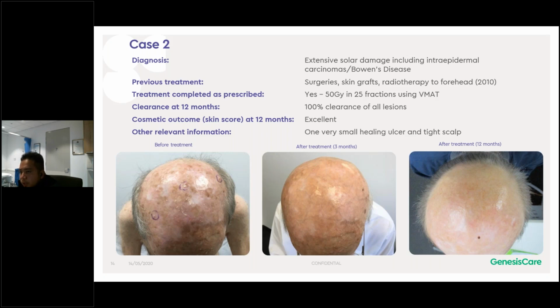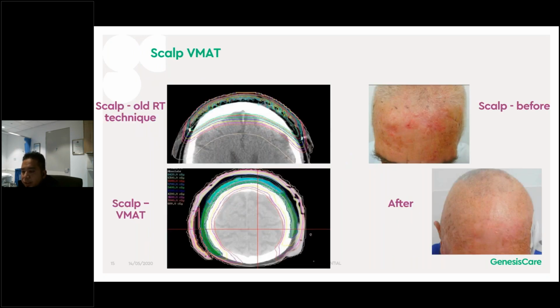over 5 weeks altogether. Another example here, actually, is a patient with a scalp or forehead lesion, and I also had the same sort of similar problem, multiple areas too big for multiple operations, being sent over for radiation. In the old days, we would have used what we call electron therapy for this big field. You can see the limitation there. Cannot treat such a big area, although it looks big already.